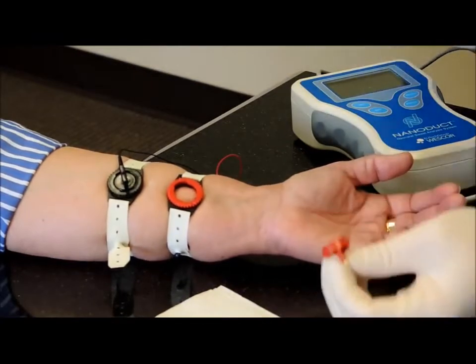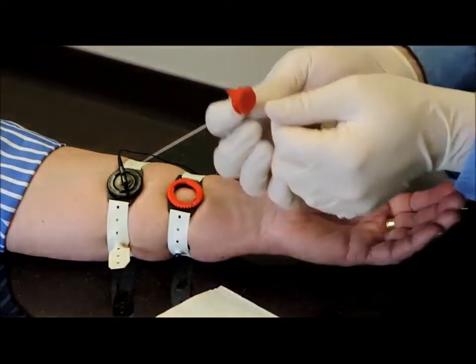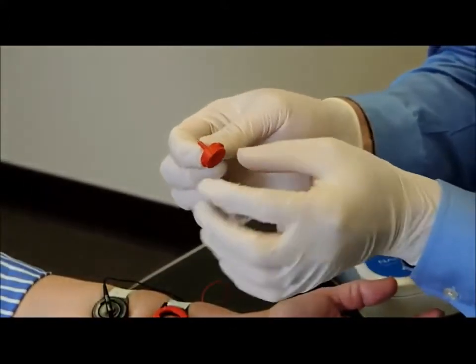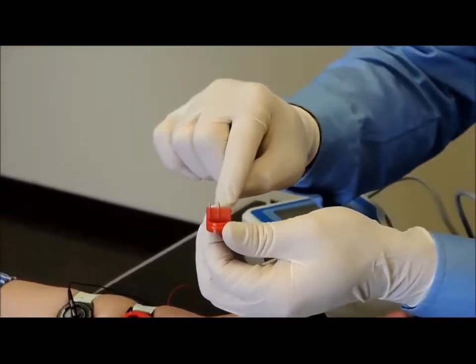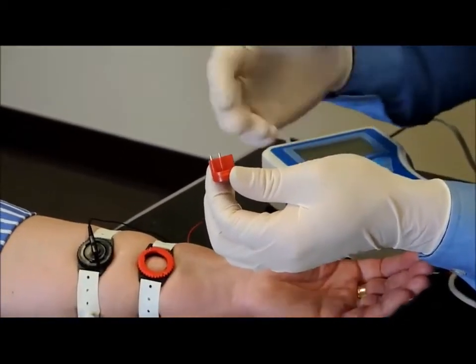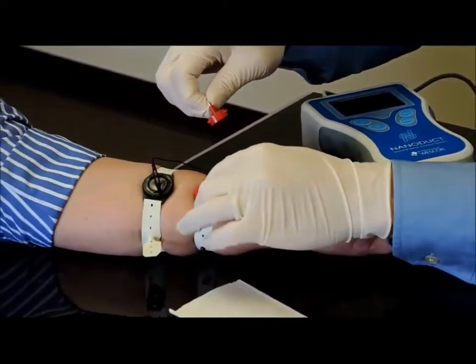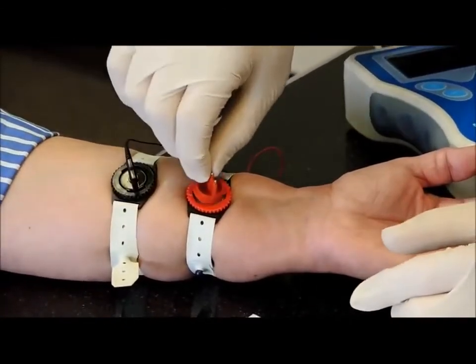So at this point we're ready to apply the sensor cell. The sensor cell has a small hole in the bottom that the sweat will funnel into, and then there's a path inside going from this electrode to this other electrode, and it measures the conductivity as it's being collected. I like to put the sensor cell in first before I connect it to the cable, just to make sure the sensor cell is seated properly.